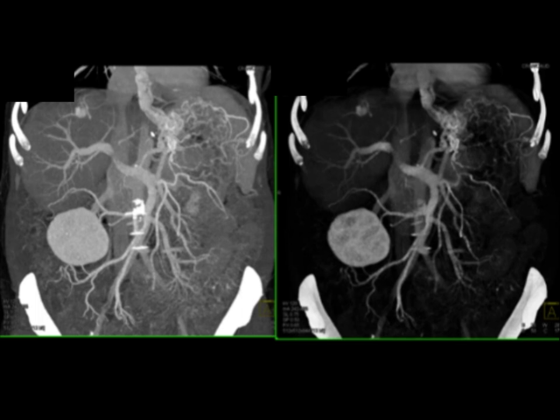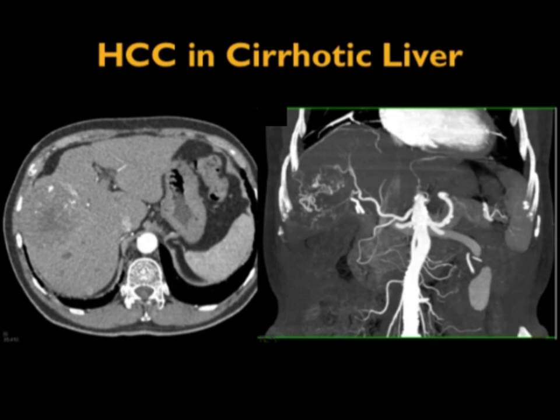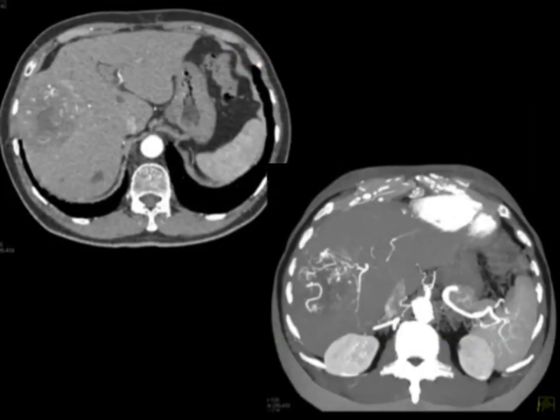You can also very nicely on MIP and volume-rendered images see the large varices in the gastric fundus and lower esophagus. It's important to look at the MIP images. With MIP imaging, you don't see irregular vascularity to regenerating nodules, but you do with hepatoma. Here's a large hepatoma — look at the neovascularity, look at the AV shunting. It's very important to recognize that often with hepatomas you're going to see neovascularity. If you have a lesion and you're not certain what it is, look at the MIP imaging — that may be very helpful to you.